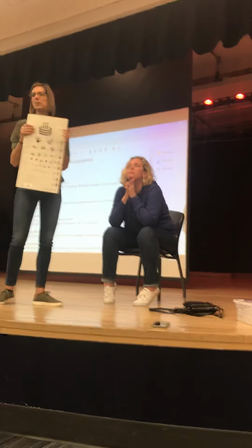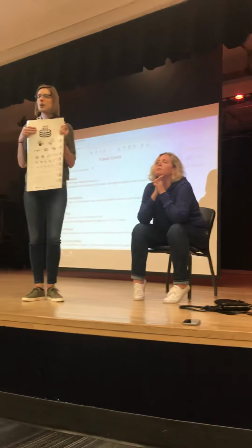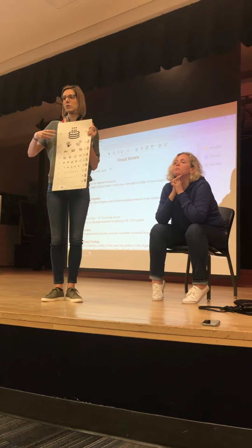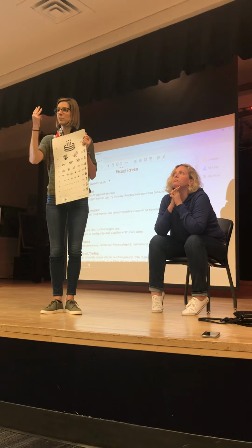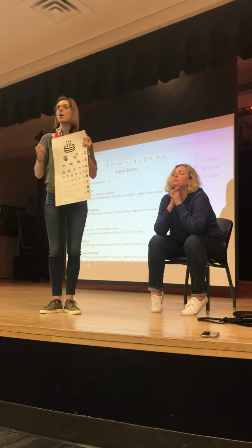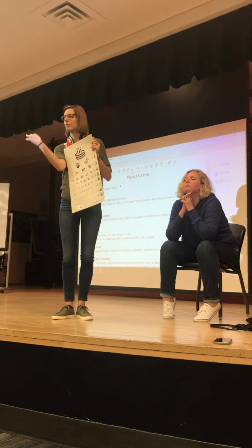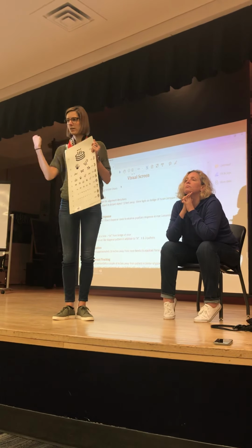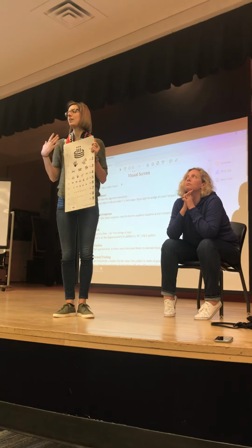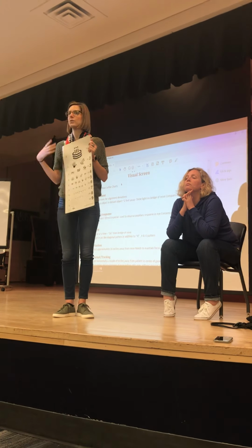Another one that I commonly use is the tumbling E's. The tumbling E chart is also used for patients with aphasia. The E is either placed this way, this way, this way, or this way. I ask them which way the three prongs of the E are facing, and they're able to point this, this, this, this. Again, they have to have that cognition to be able to follow the commands.